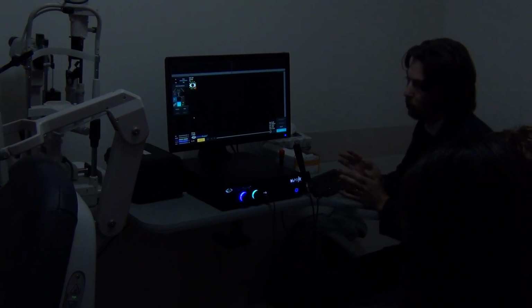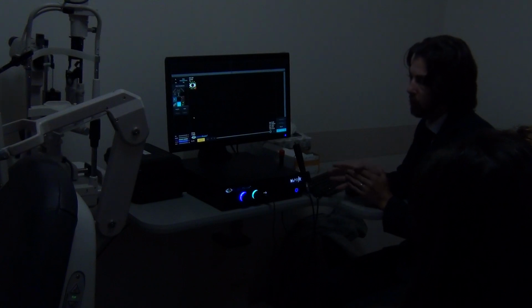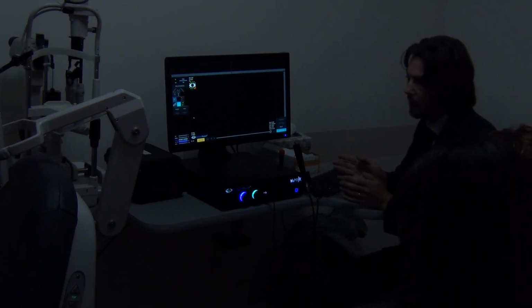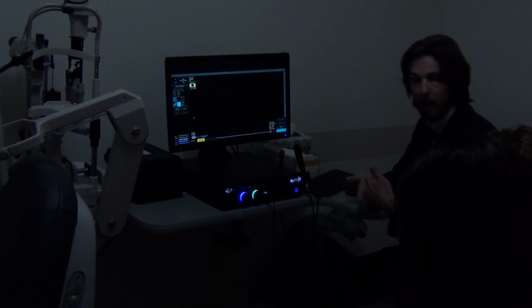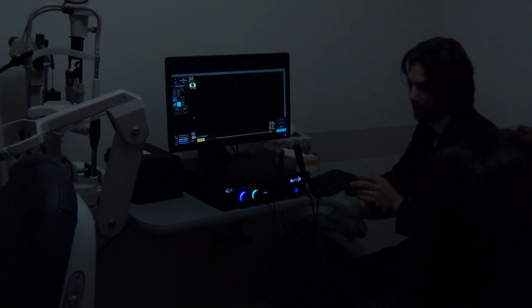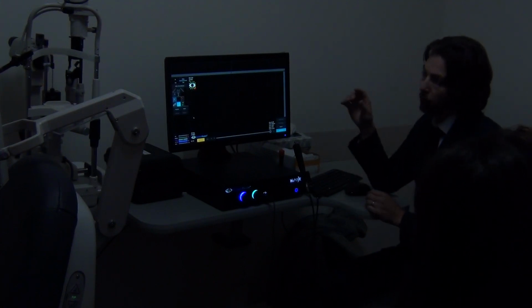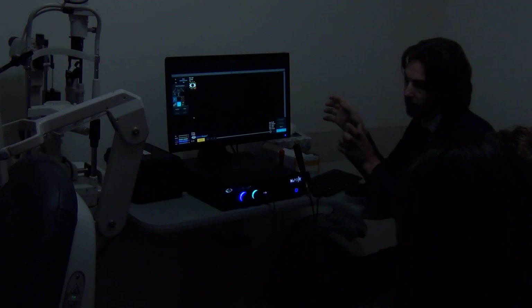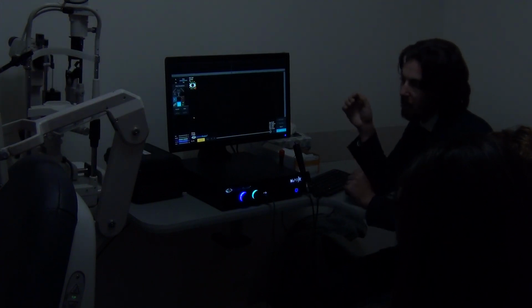It will provide you multiple dimensions on the screen while you perform test, because you need to be properly aligned to the visual axis. You need to be right in the center of the cornea and go straight through the pupil and the lens itself. So unit will provide you the corneal thickness, the ACD, also the lens width, and the sulcus to sulcus measurement.